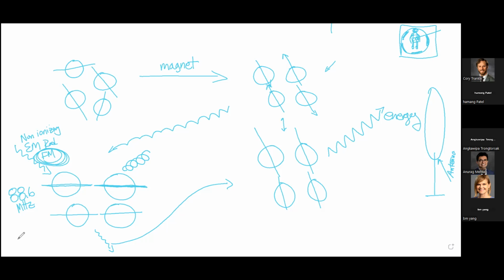So why is that scanner in a room that's all closed off? When you have scanners in the cath lab or CT scanners, we put those in rooms because there's ionizing electromagnetic radiation in the room that we want to prevent from getting out.